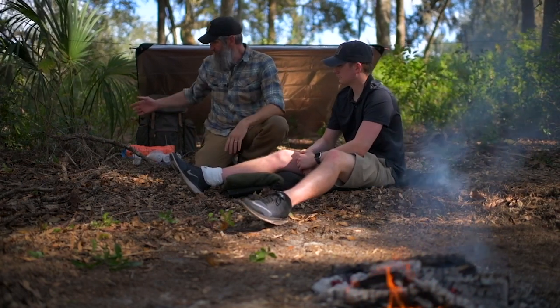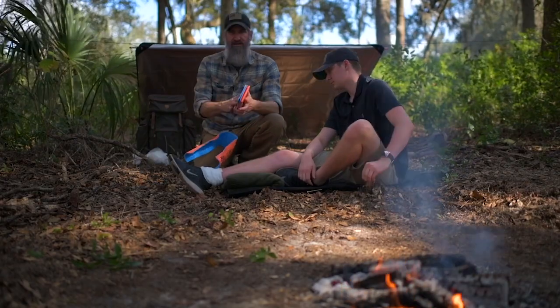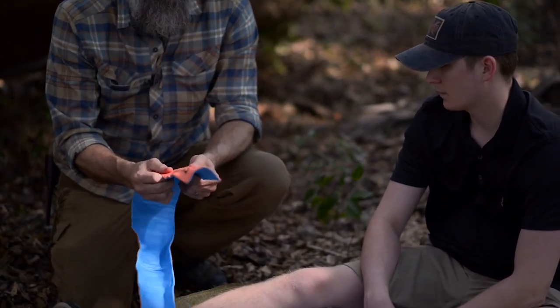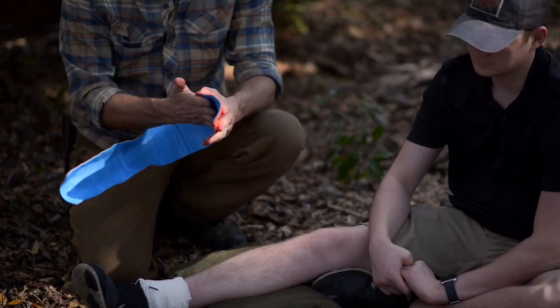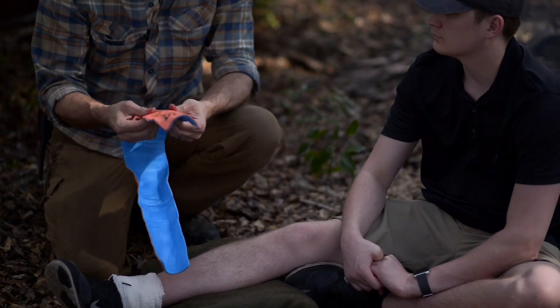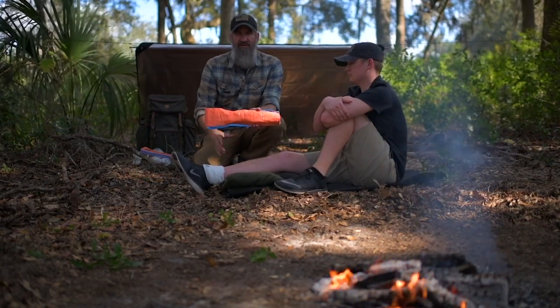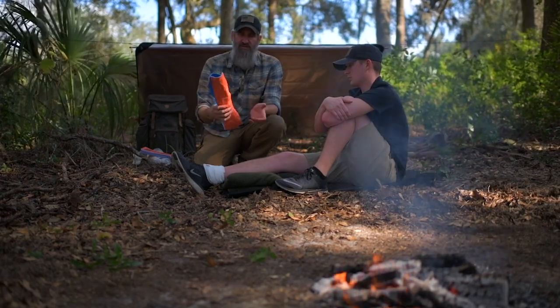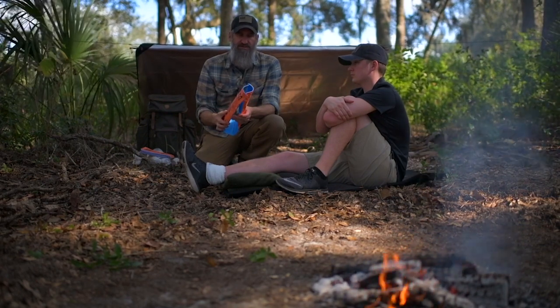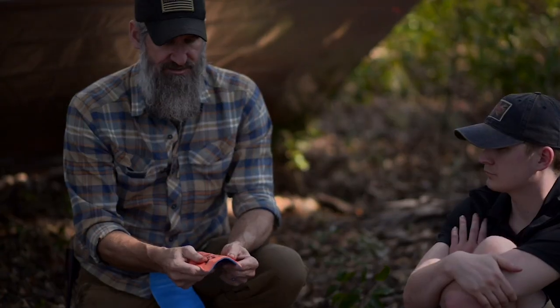For rigidity, we have the SAM splint — this is what they look like folded up, nice and flat. It's essentially a sheet of moldable aluminum with foam padding over top, and you can mold it into several configurations to fit different injuries. Importantly, they're radiolucent, so you can leave this on at the emergency room and they can x-ray right through it. That's why I prefer these — they're lightweight, packable, moldable to a multitude of injuries, and radiolucent.